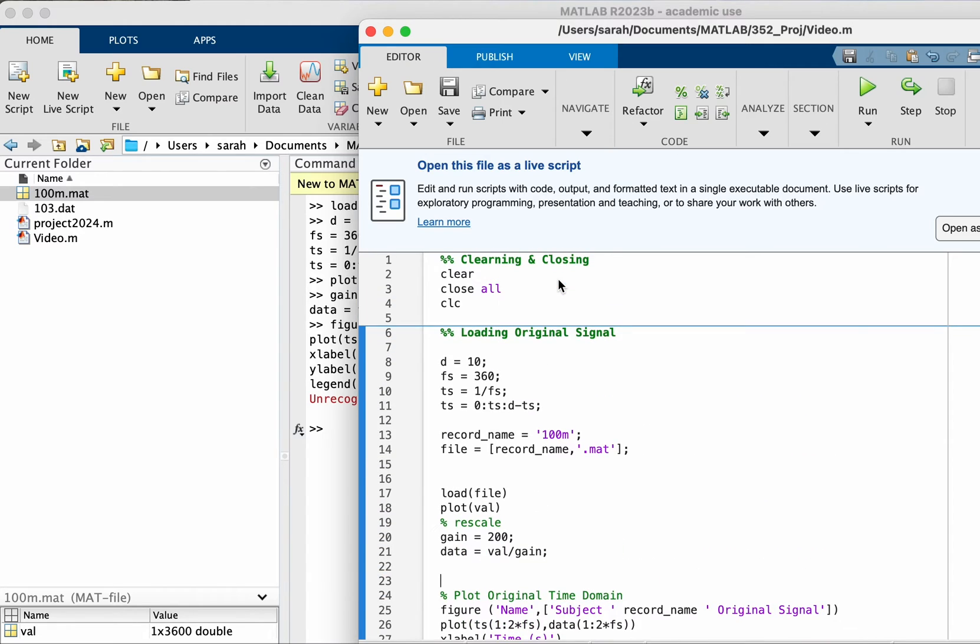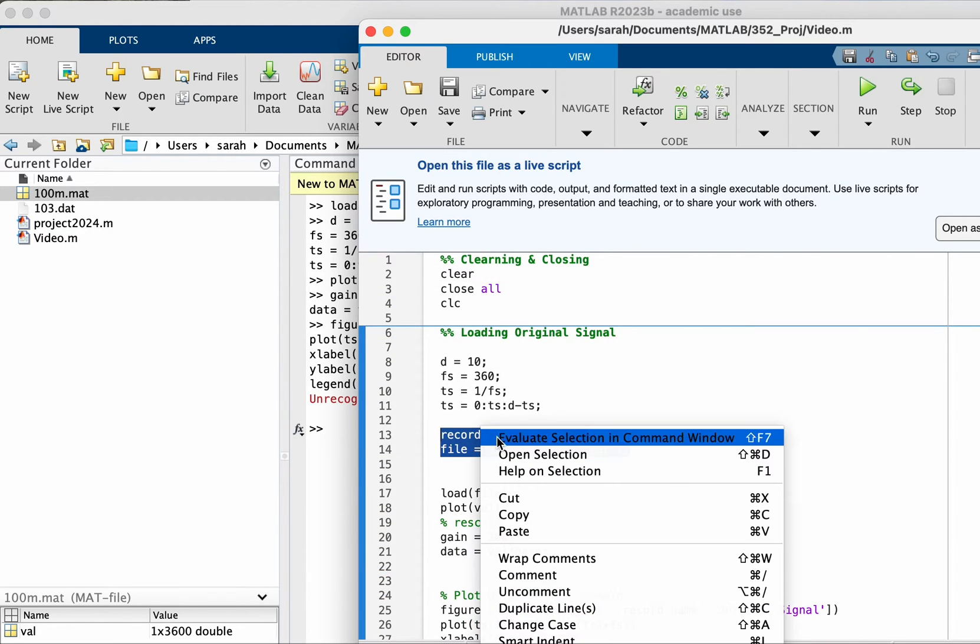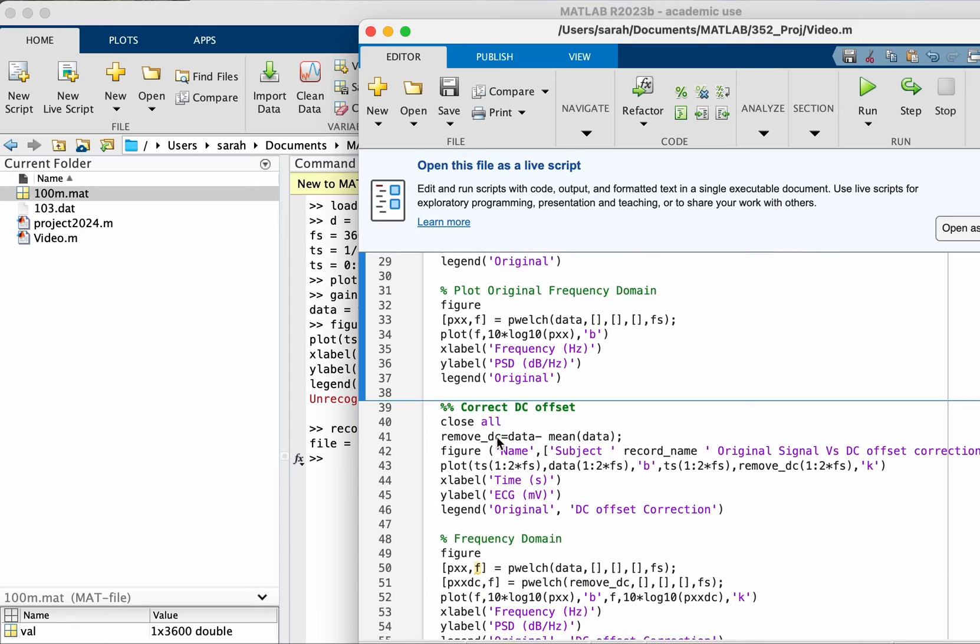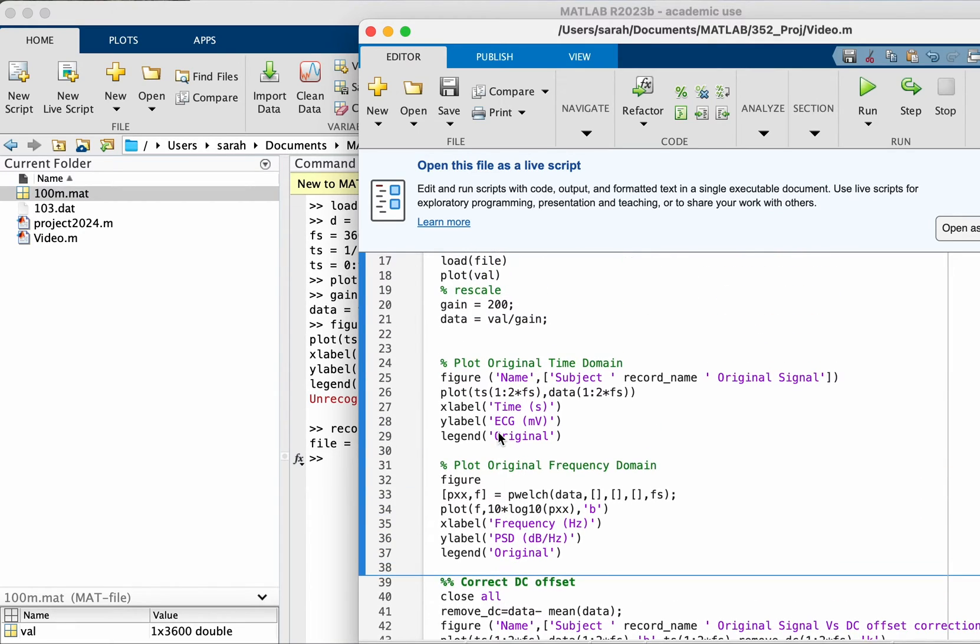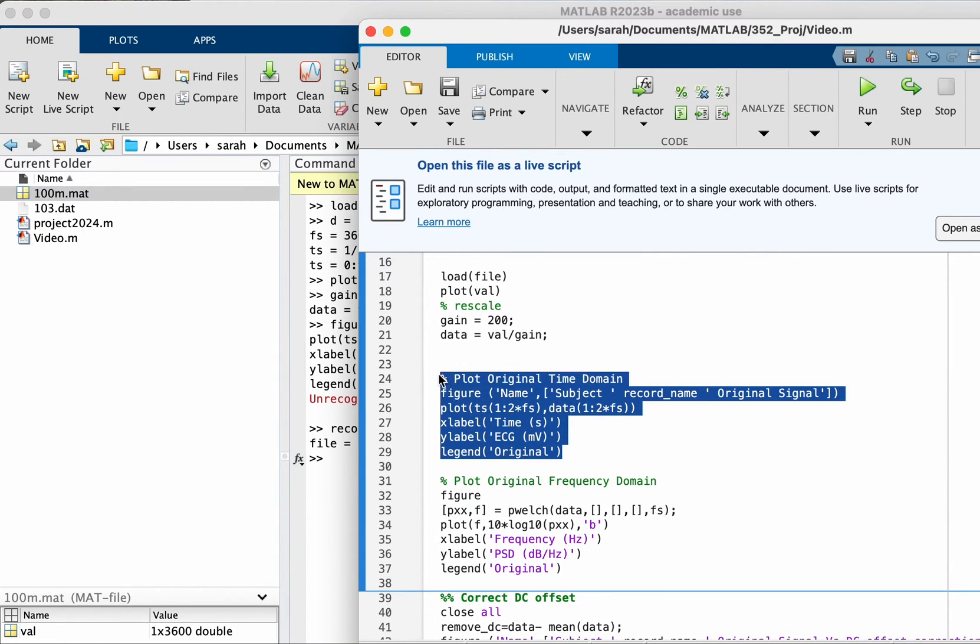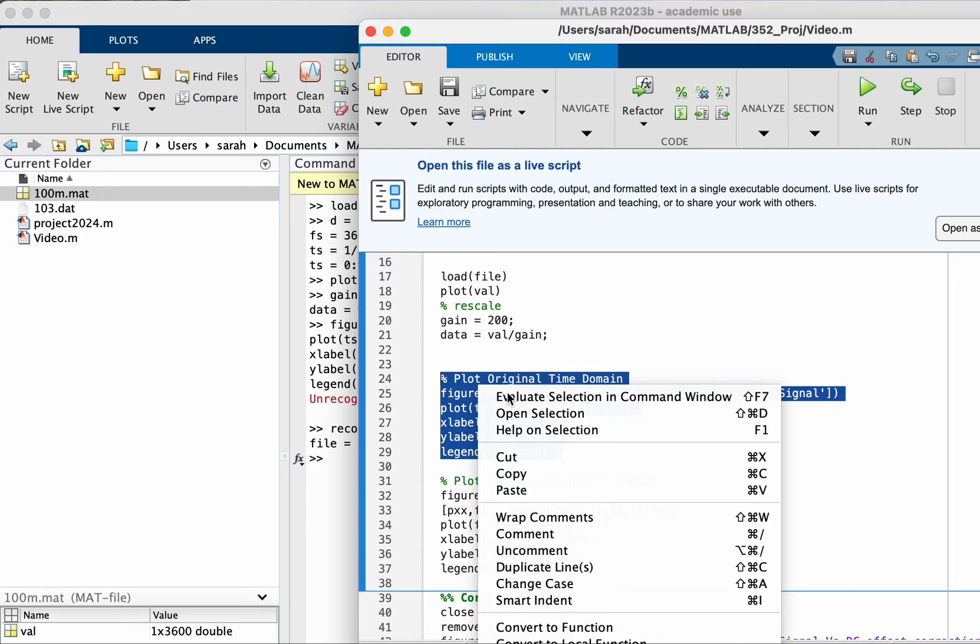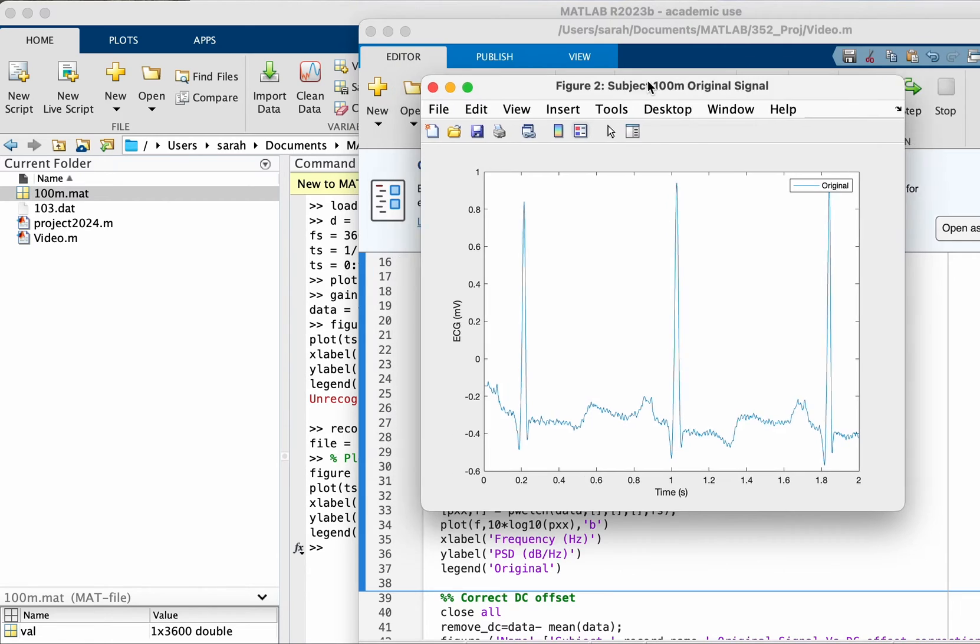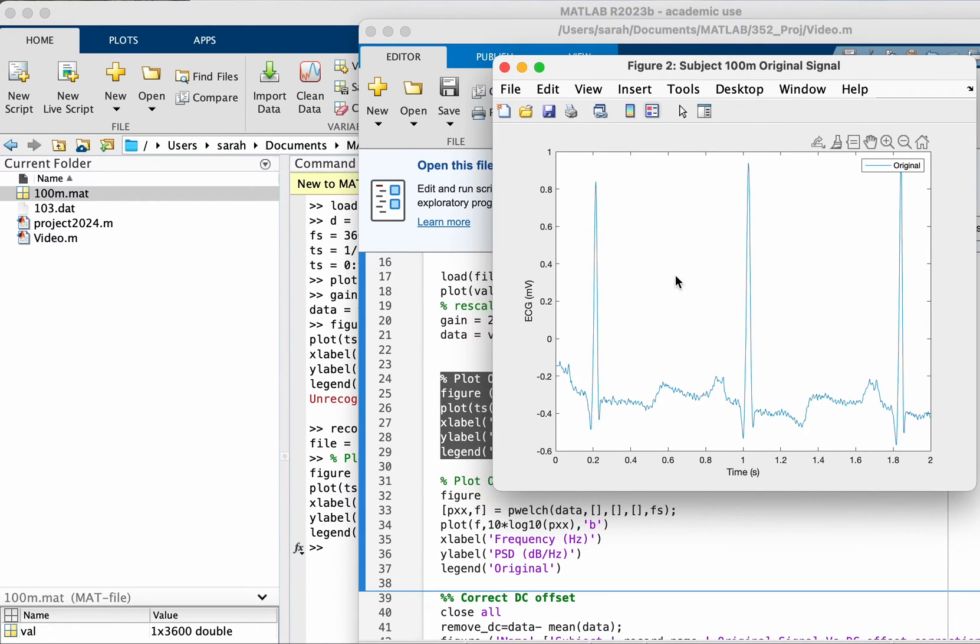Let's run this and then plot the signal. So this is actually the ECG signal after scaling the amplitude down and then taking just two seconds of the signal.